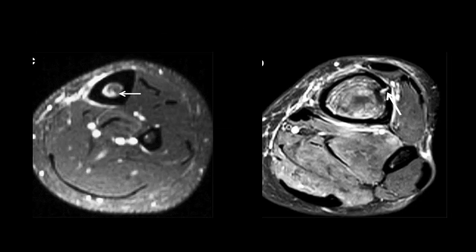The difference between a shin splint injury and a stress fracture: no obvious intracortical fracture line is seen in shin splint injury, whereas a fracture line will be visible in a stress fracture. The bone marrow edema is usually extensive in a stress fracture and involves almost the entire cross-sectional area of the bone, whereas in shin splint injury the bone marrow edema is focal along the endosteal surface. The soft tissue edema is also more extensive in a stress fracture compared to a shin splint injury.